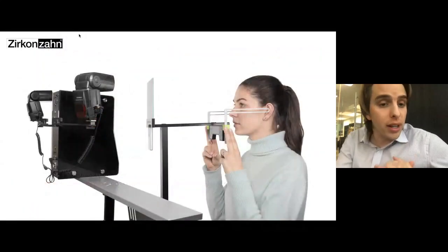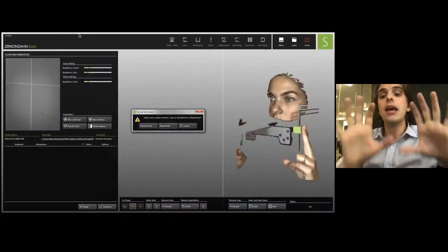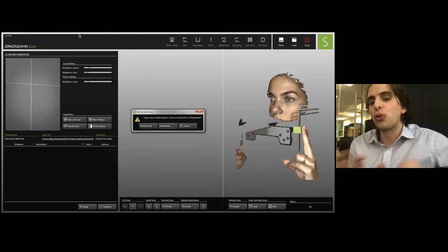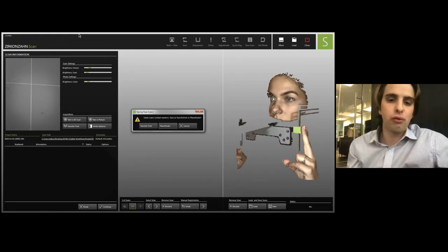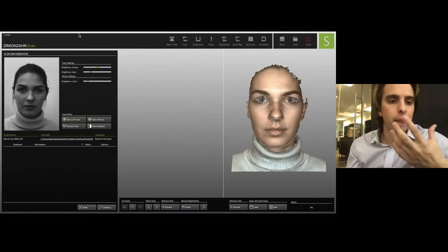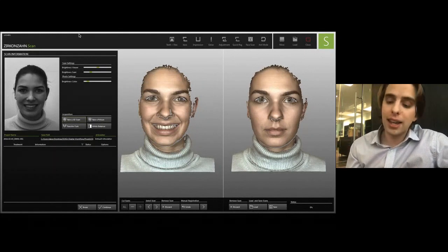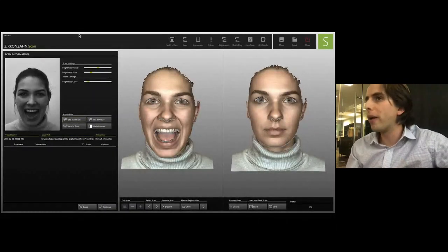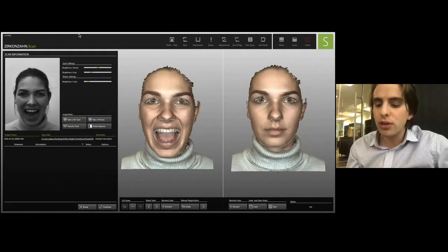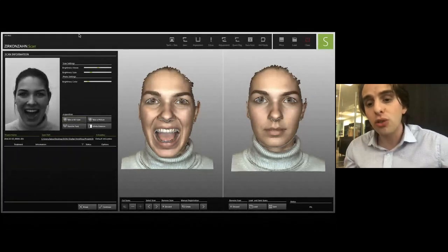We go with the 3D facial scanner, the Face Hunter, and we capture this natural head position. And now the natural head position is affixed within my virtual plaster room, my scan software. And with the Face Hunter, we assemble a few additional scans: the portrait, the left, the right, the smiling, a series of aesthetic images such as mouth wide open, the resting lip position, the letter A, S, F, whatever you need to assess aesthetics. And we go to merge these individual facial scans together.